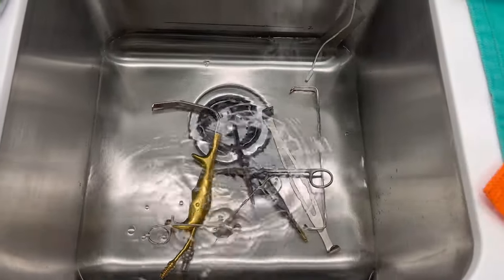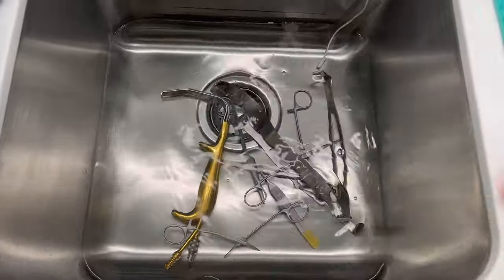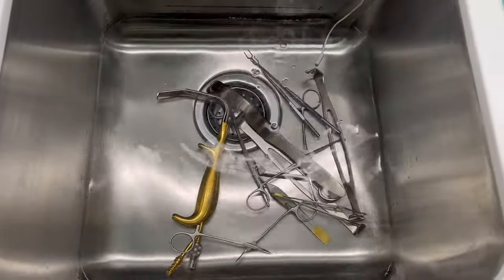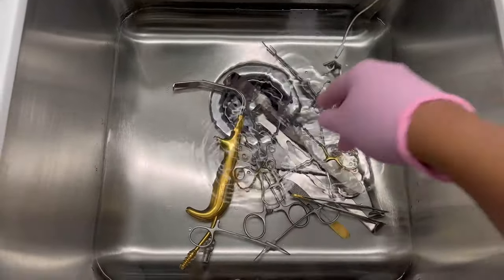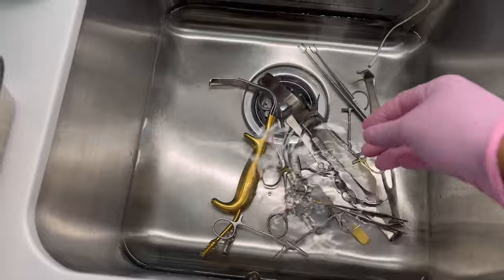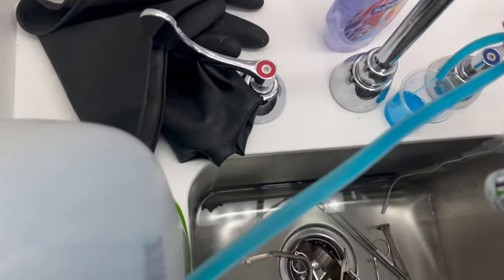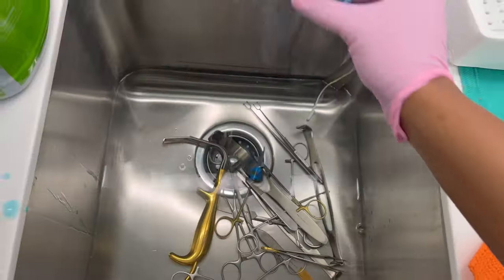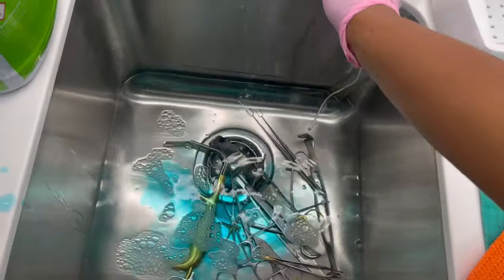I put all the instruments in water and leave them to soak with the, I'm going to find the name of this liquid that I'm trying to tell you guys about. The soap, whatever the soap is called, I pour that in there. This blue thing is what I put in. Again, you want to follow the instructions for how much to use. I think for mine it's like a gallon of water per 1 or 2 ounces or something like that. I put that in and then I just let them soak.